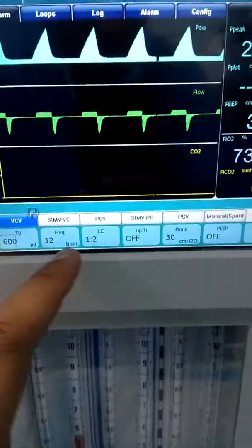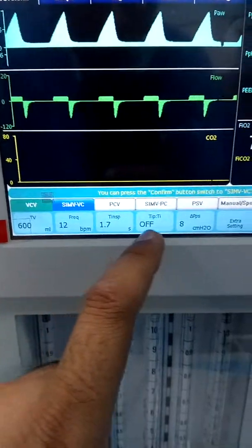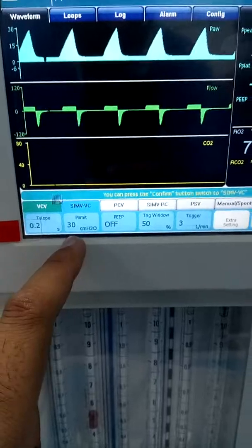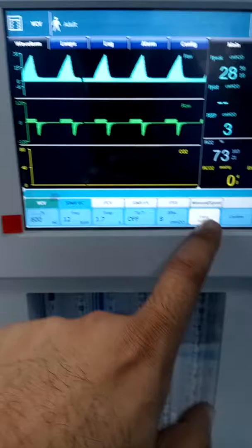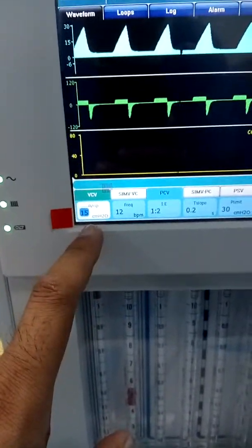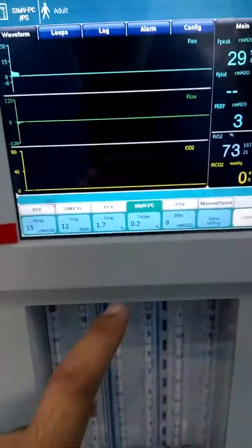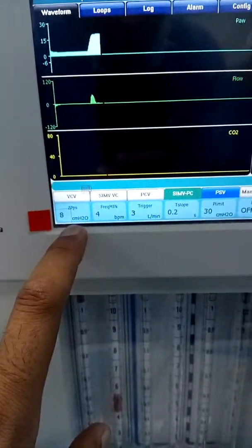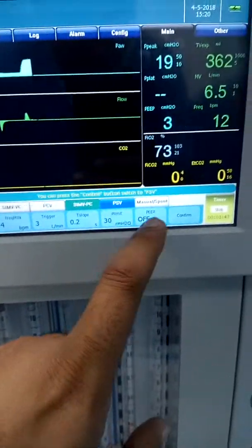Under all modes you can see the settings. Under volume control, these are the settings. Under SIMV volume control, there are extra settings: time P and trigger window. Under pressure control ventilation you can set the pressure. Under SIMV pressure control these are the settings. Under pressure support ventilation you can set the pressure support, frequency, trigger, T-slope, pressure limit, and P.